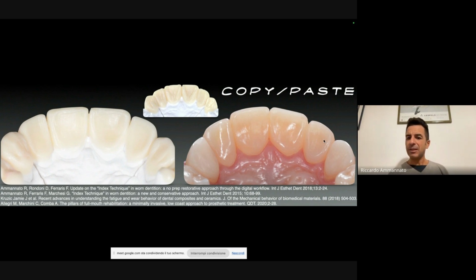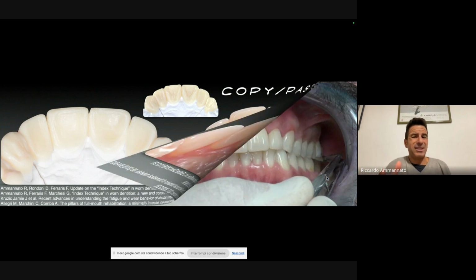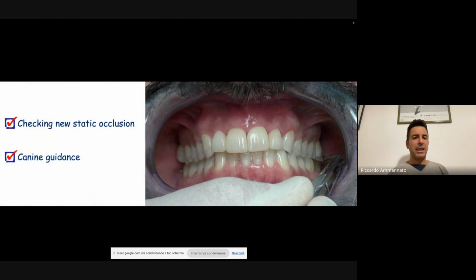So again, from lateral to lateral, from the internal side, you can see the molding, and these instead are the glass ceramic veneers. And you see, I asked the technician to be short. I don't want to reach the intrasulcus level because I need to place the dam, I need to do my bonding procedure. So there's no need to go inside the periodontal area.